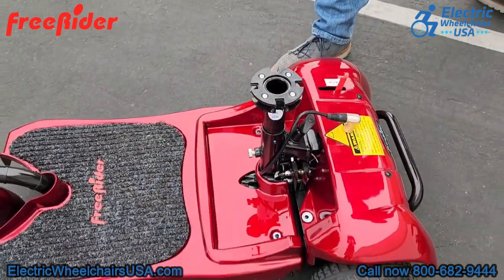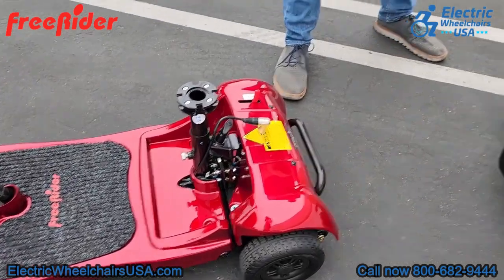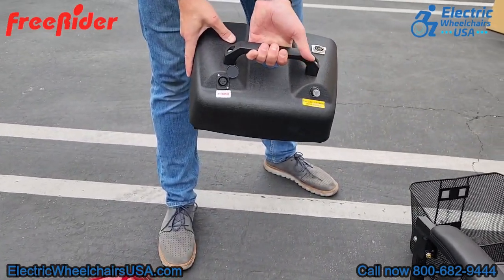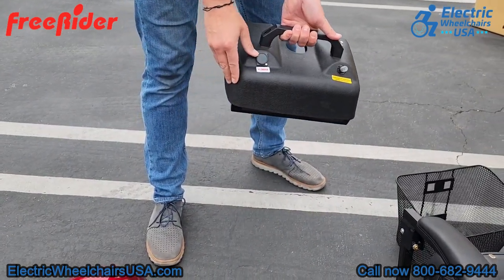You can also remove the battery pack and charge it separately. A lot of our customers like to take the battery pack off, leave the scooter in their garage, charge the battery pack in their house, and once it's finished charging, take it back out to the garage and put it back on the scooter.